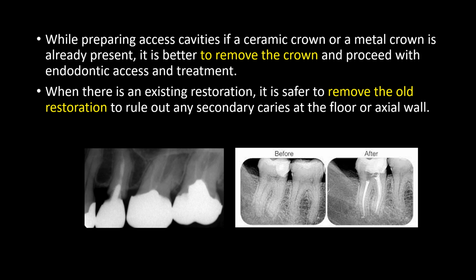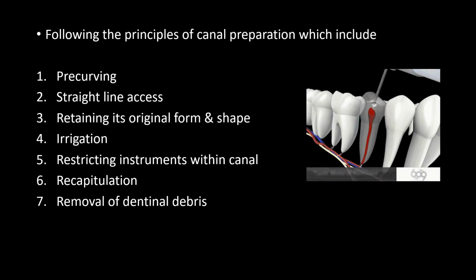floor or axial wall, following the principles of canal preparation, which include precurving. Straight line access. Retaining its original form and shape. Irrigation. Restricting instruments within canal. Recapitulation and removal of dentinal debris.